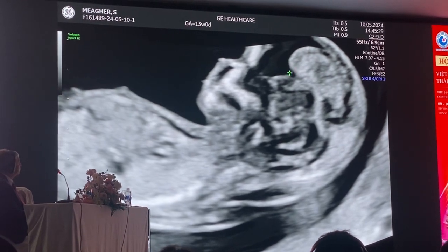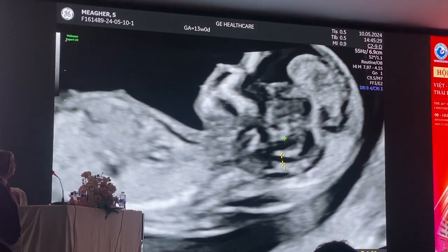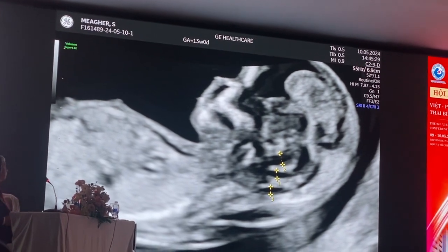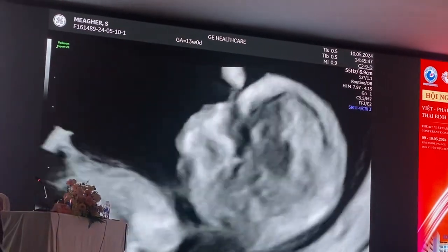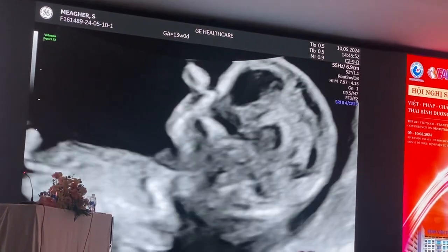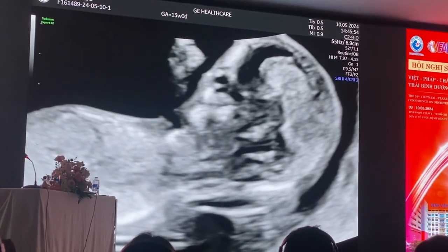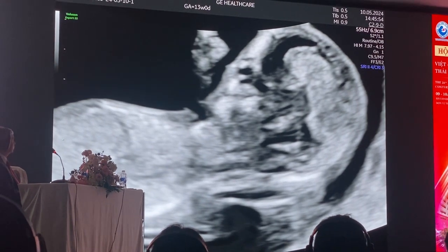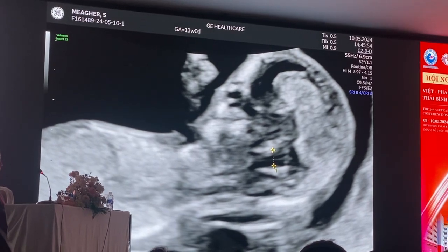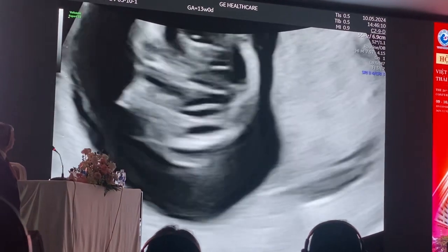I also save that. If I go to try to get better measurements now of the midbrain and the brainstem, I think I have a better intracranial translucency measurement, so I measure from here to here. I think I also have a better brainstem measurement here, and a better cisterna magna measurement here. Sometimes, when you take these measurements of the brainstem, you're not actually getting a perfect mid-sagittal section, because sometimes it's quite oblique. If you look at this measurement there, I do not have a mid-sagittal profile, but I have my best midbrain measurement. That's the best one which I've obtained. So sometimes when you're taking intracranial translucency, it's in that section.